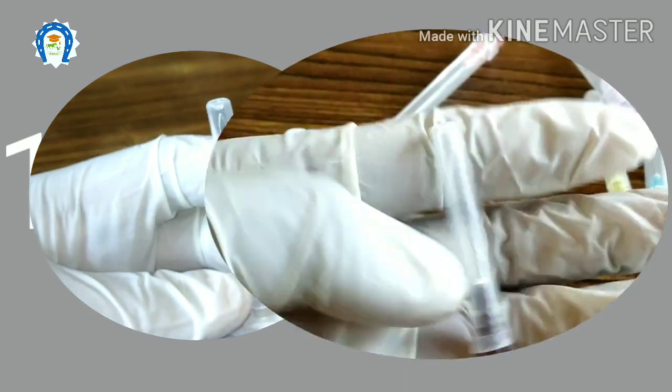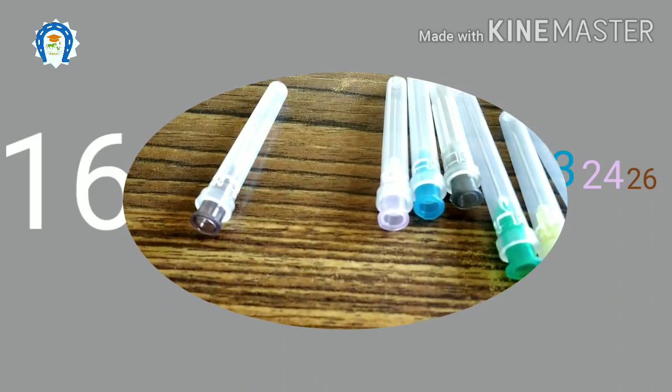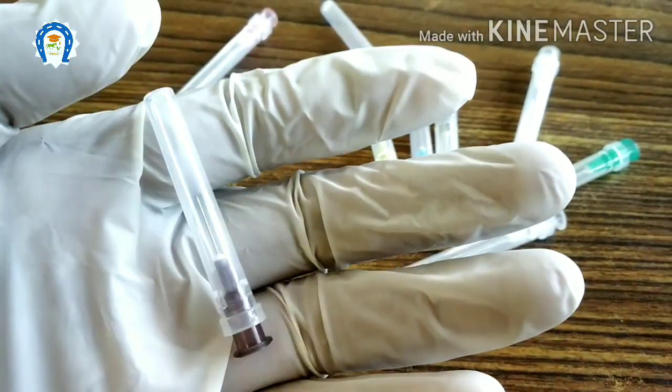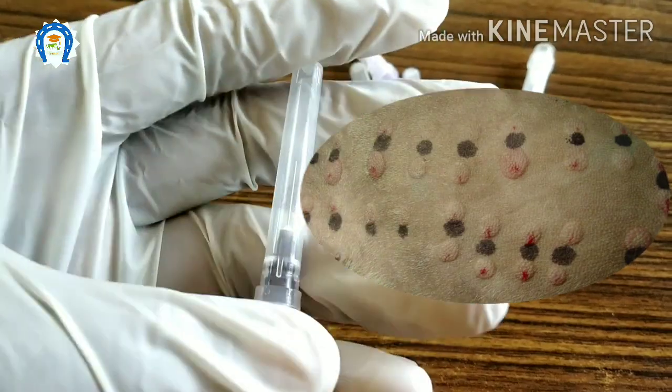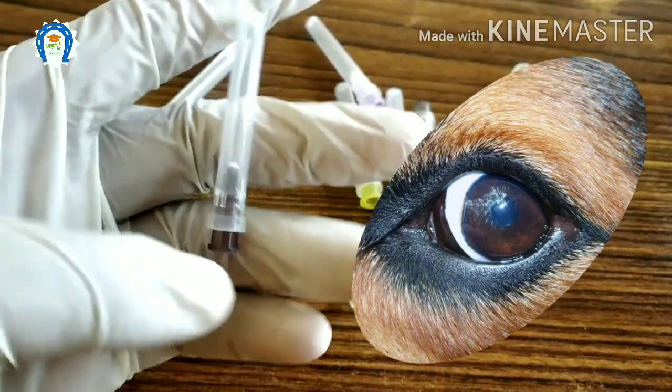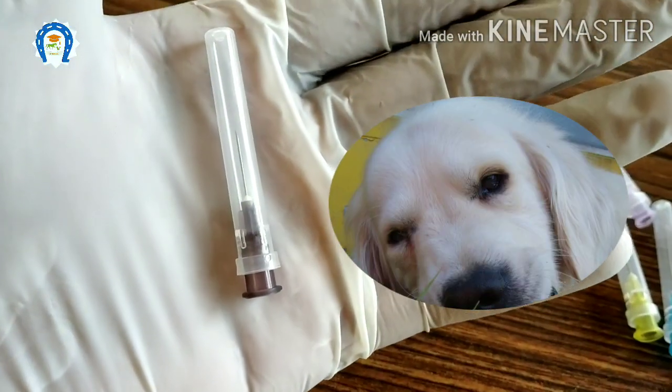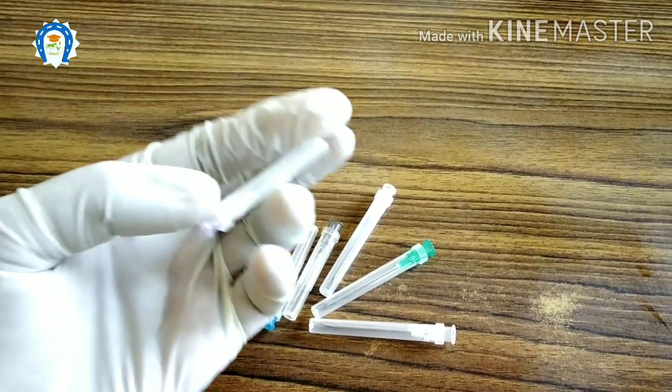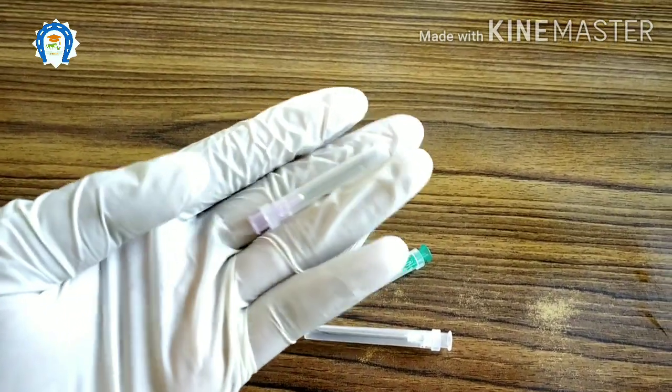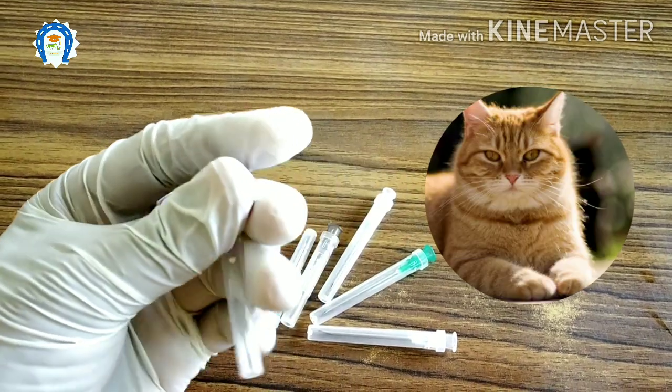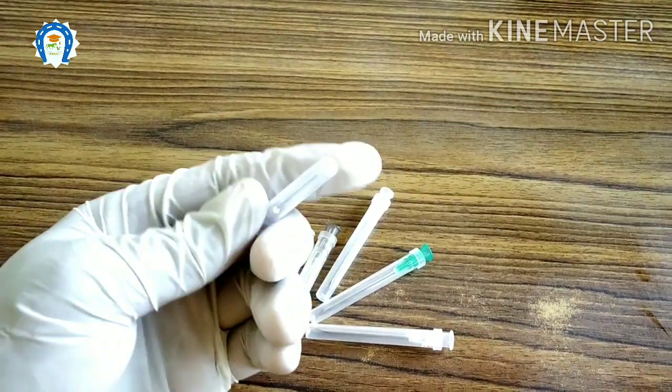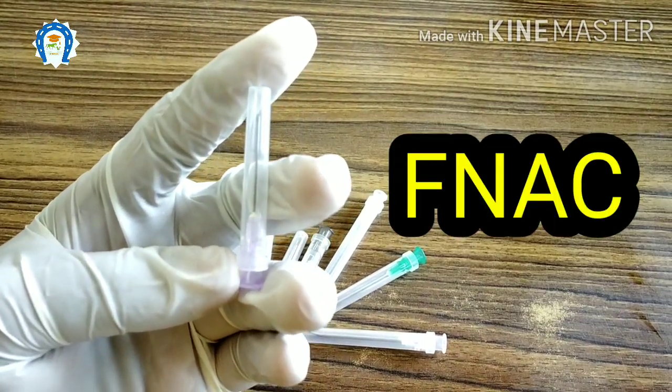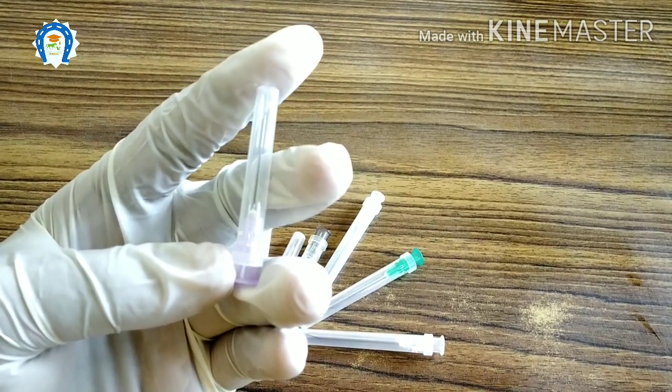Now we will see the needles one by one. First, let's start with the smaller size needle. This is the 26 gauge needle. This is brown in color. This is commonly used to give intradermal injections. We can use this for subconjunctival injections, and this is the ideal needle for fine needle aspiration cytology studies. This is suitable for birds also.